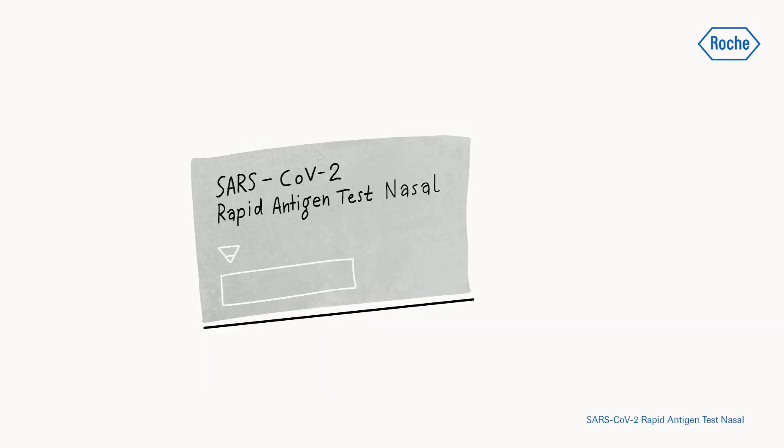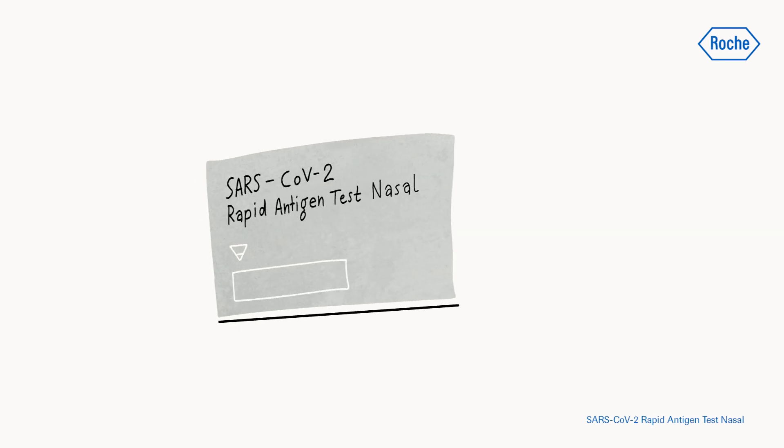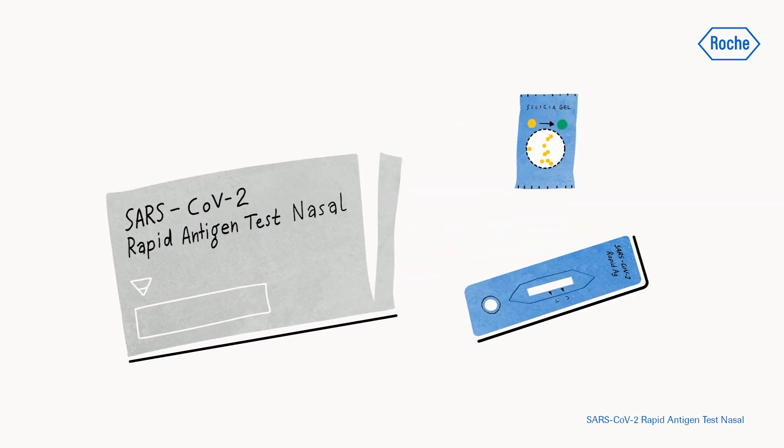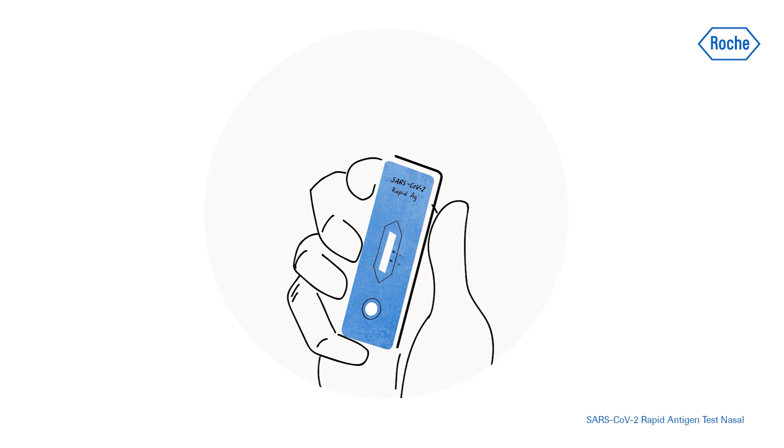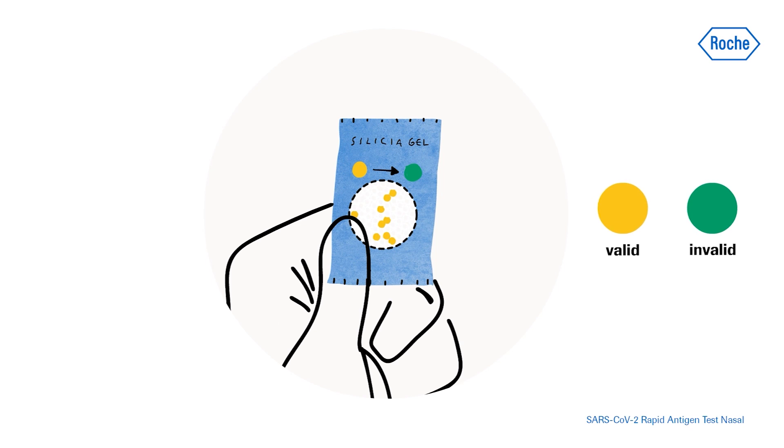For each test, check the expiry date on the back of the foil pouch. Do not use the test if the expiry date has passed. Open the foil pouch and remove the test device and the desiccant package. Ensure that the test device is undamaged and that the desiccant status indicator is yellow.